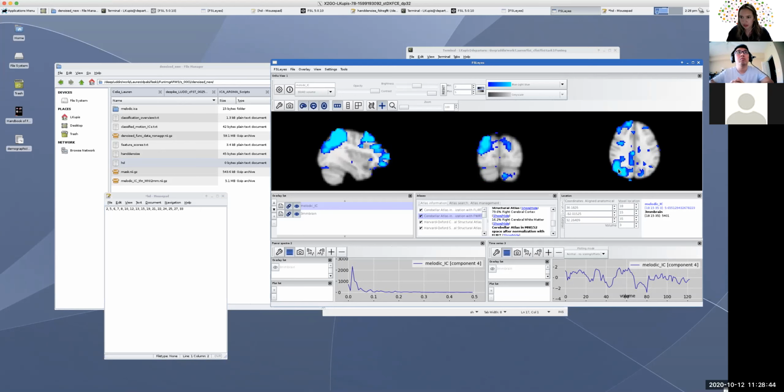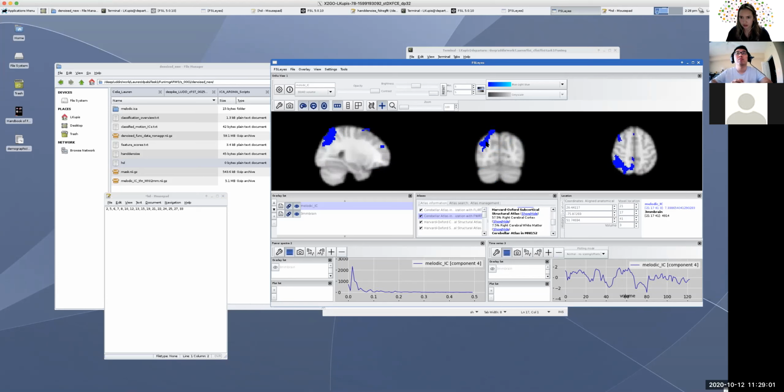Yeah, so then this one, it's looking pretty good also. Again, just checking here. A little bit of white matter, so I might zoom in on this one just to double check the brain region. Got a little bit more. Okay, still cortex.